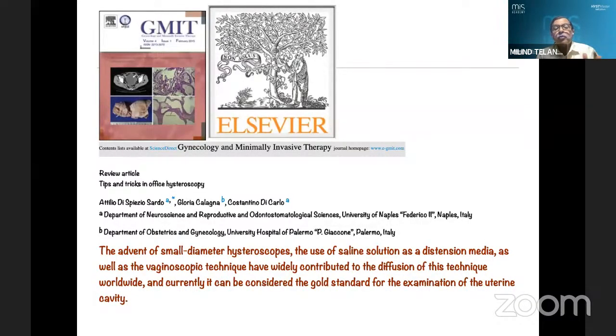The tips and tricks have also been mentioned by Attilio in his very famous publication, wherein he says small diameter hysteroscopes, use of saline solution as distension media, and vaginoscopic technique have contributed to this technique being accepted worldwide. India has a large number of patients who can be treated in the office. I say that each one should try office hysteroscopy, come out of their comfort zone and try this process.